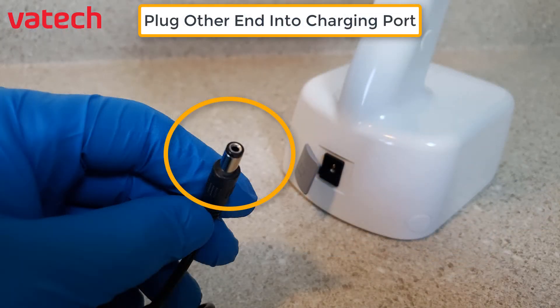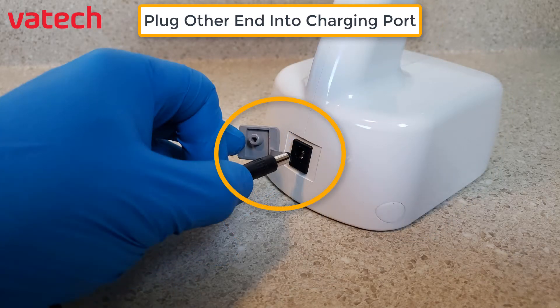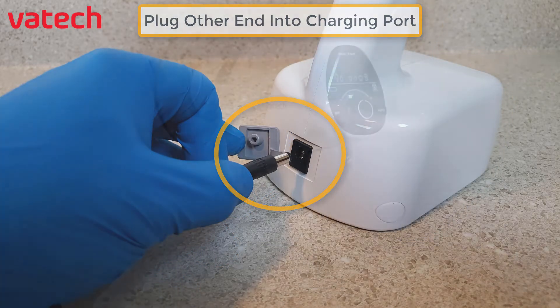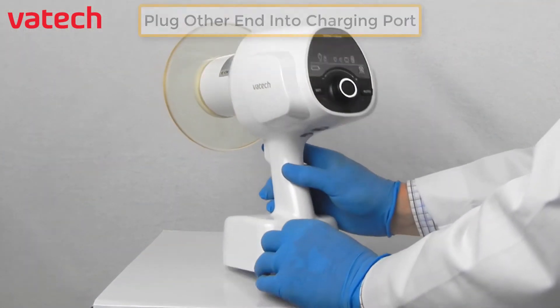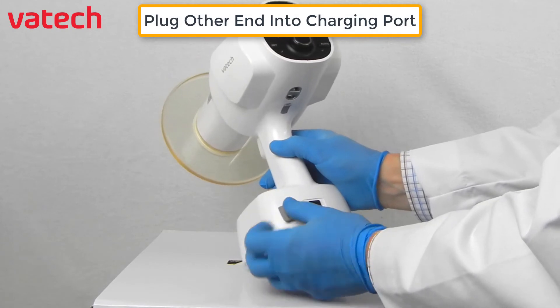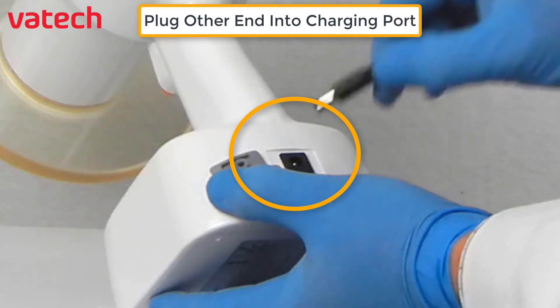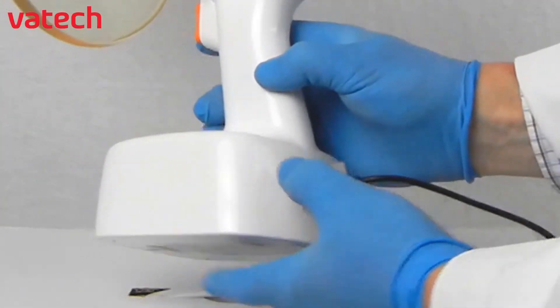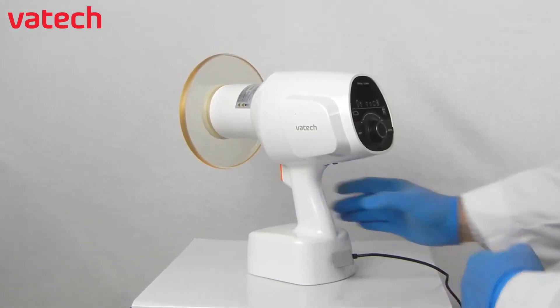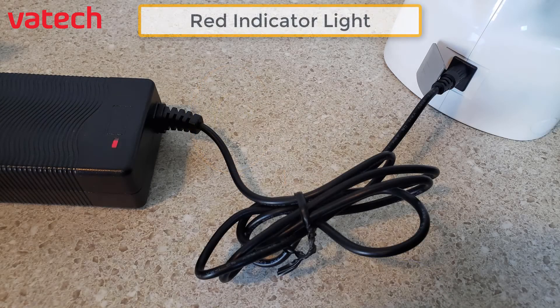Take the other end and insert it into the port on the back of the EasyRay Air Portable. For a live demonstration, we'll open up the back port, take the other end of the charger, and insert it into the female receptacle. To verify that it is charging, the green indicator light will then turn red.